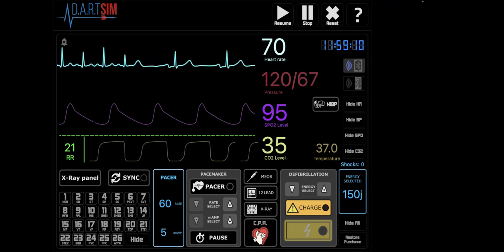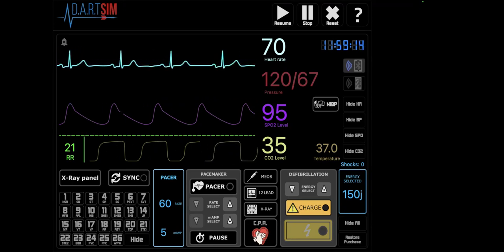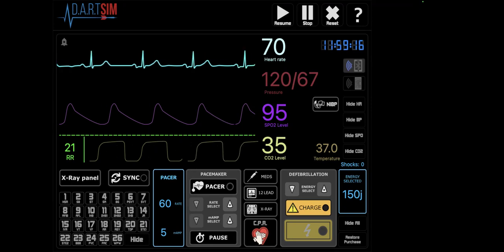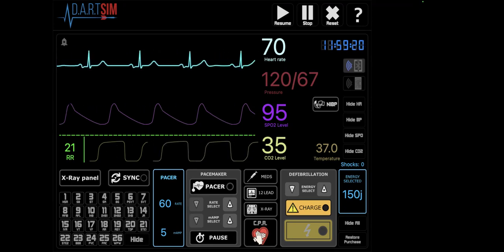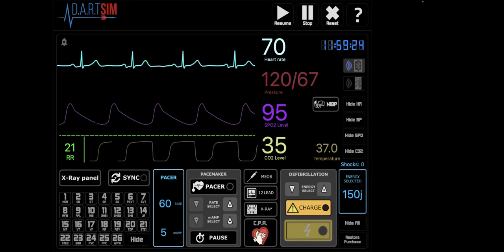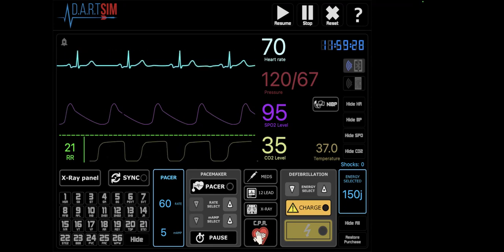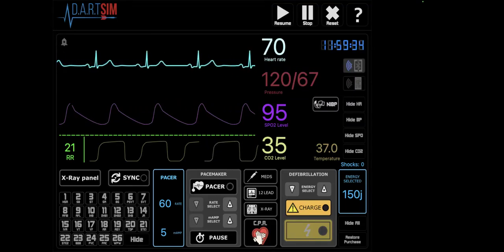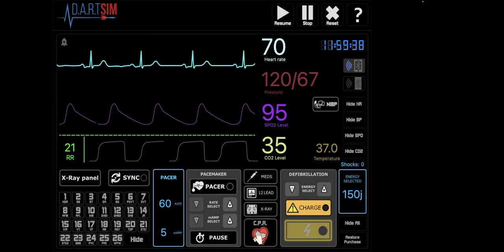Now, we also have to determine why the patient developed symptomatic bradycardia, but that is after the fact. We need to manage the patient because he was unstable, and then we have to investigate why did this happen. So that is our first kind of look at a patient. Let's look at another patient.